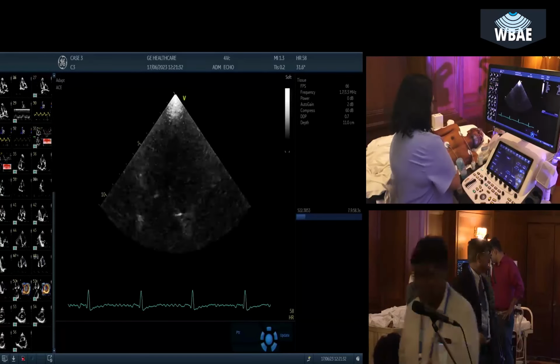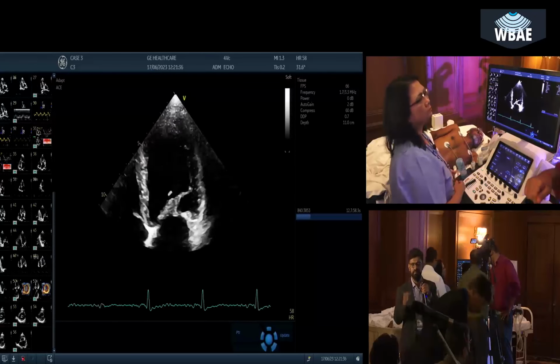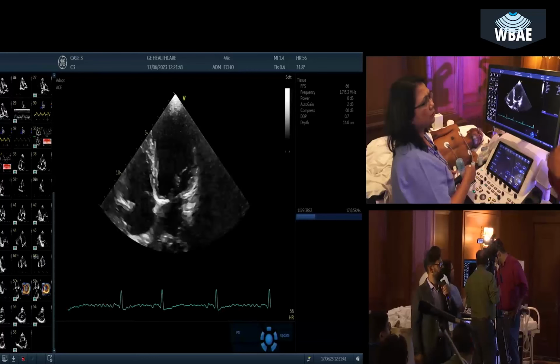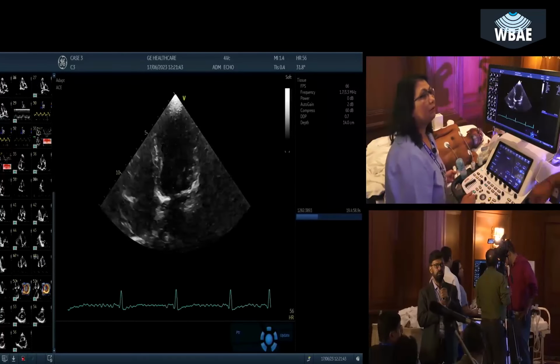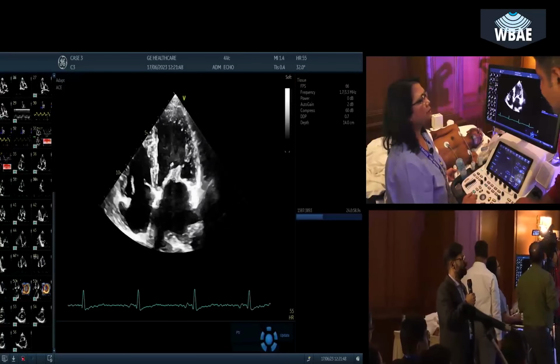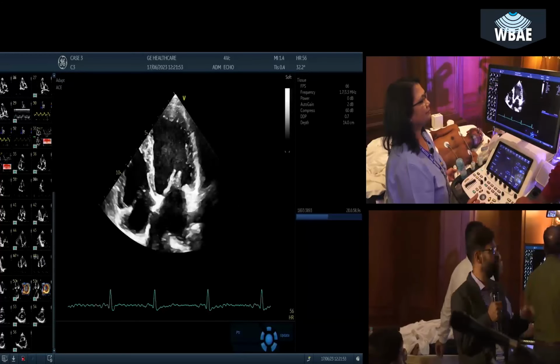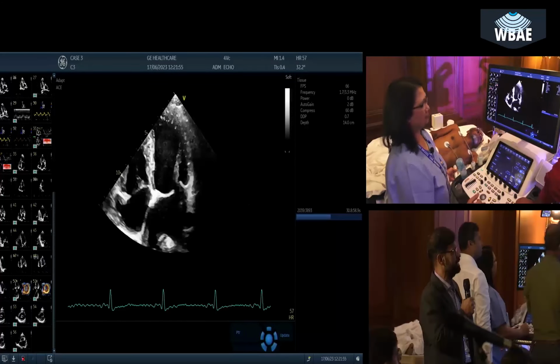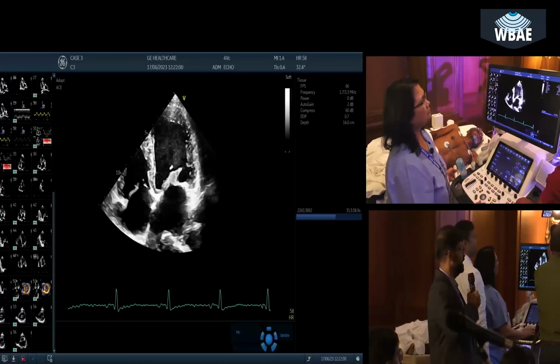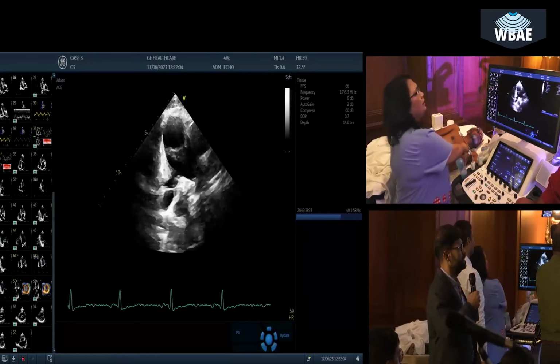So there was a guideline statement which came from the American Society of Echocardiography. Dr. Pandian is the first author, and myself and Dr. Mohan were a part of it. We had the privilege of contributing. So the guidelines have changed a little bit in mitral stenosis, and I think we should emphasize it. The parasternal long axis view showed us that this is a rheumatic mitral valve. So we have the parasternal short axis view for the mitral valve area. We have saved it.